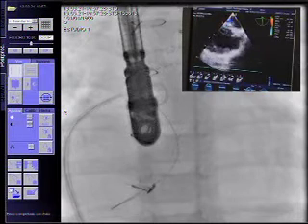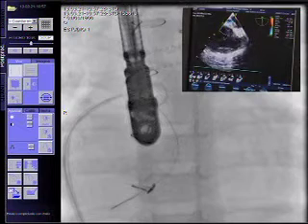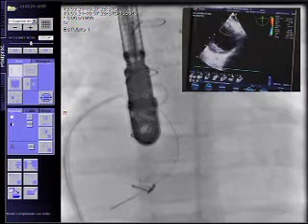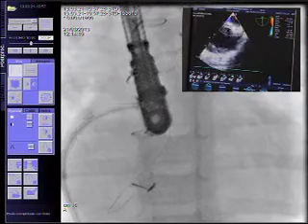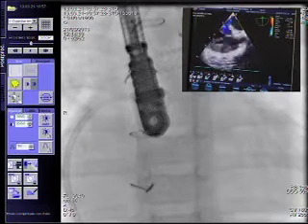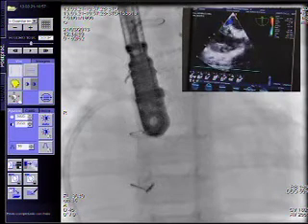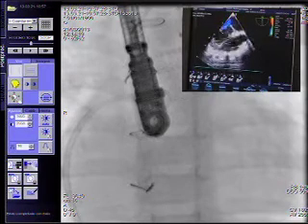We were commenting on the case before the live connection. We had 3 plans, and finally we have a 4th one that is really acceptable, I think. The hemodynamics, as you see, are pretty normal, but maybe one of the things we were talking about is what the surgery plan was, and how long we were going to wait for the surgery. So it's not a bad idea to maintain unrestricted the communication between both atria.